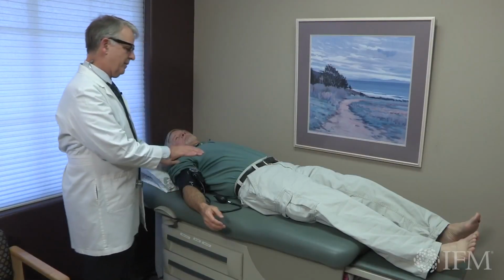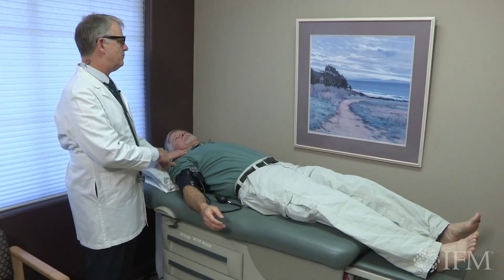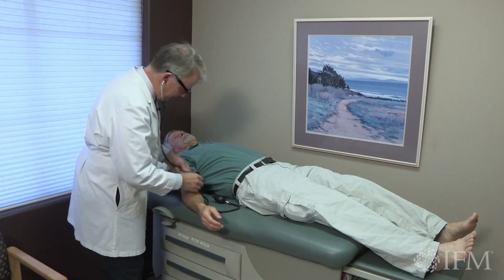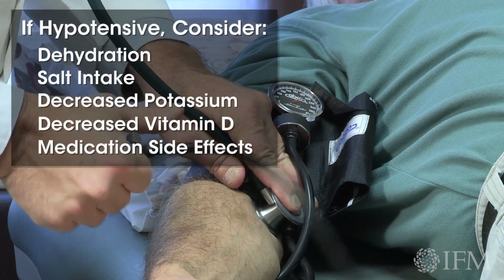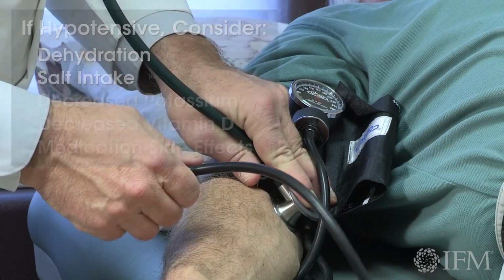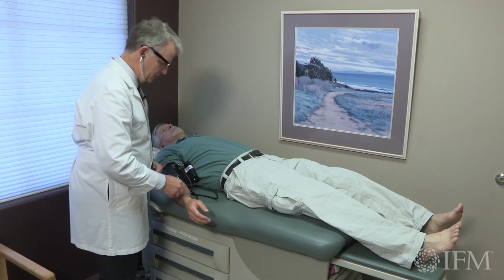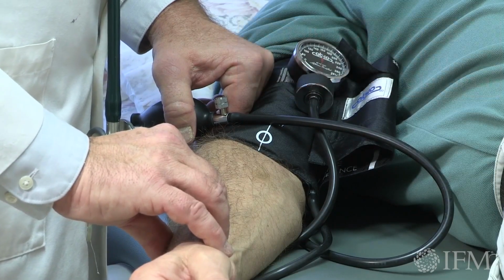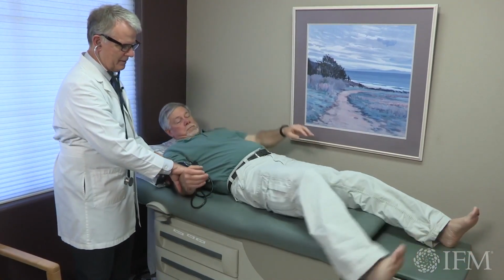So Steve, we're going to check your blood pressure lying flat, and then I'm going to have you stand up. So what am I looking for here? I'm going to be checking your blood pressure and your pulse when you're lying flat and see if, when you stand up, your blood pressure drops 20 points or your pulse goes up 20 points, okay? So I'm going to first check your blood pressure here, lying flat. Right, I'm going to check your pulse here. All right, so you're right at 60. So I'm going to have you swing your legs around and stand up for me. Stand on the floor.